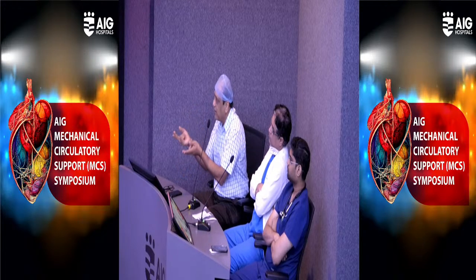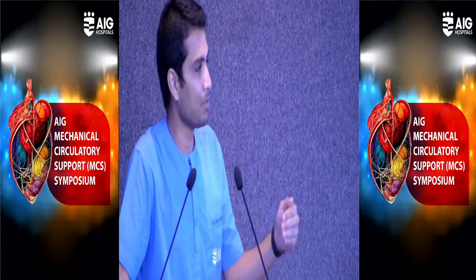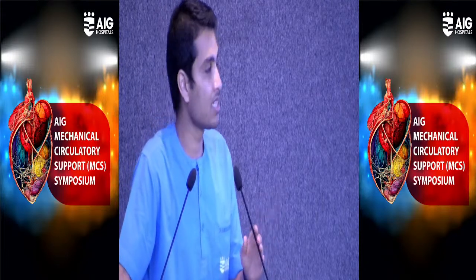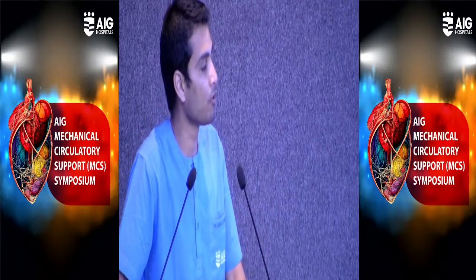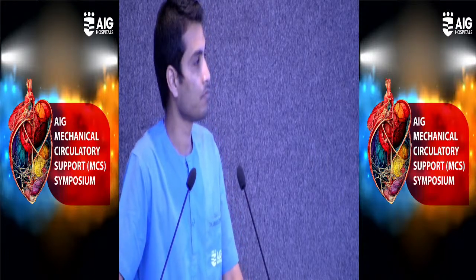So there are two ways of handling it. One is to convert to central ECMO. One has to do a transseptal on a patient with an ECMO, and that's the only thing. Sometimes even putting in a Swan in a patient with an ECMO can be challenging because there's a lot of inflow drainage happening from the IVC. You already have a large catheter there.